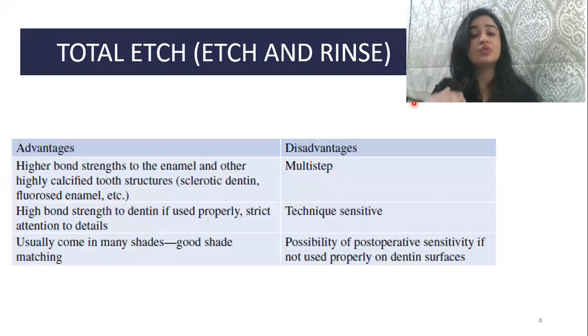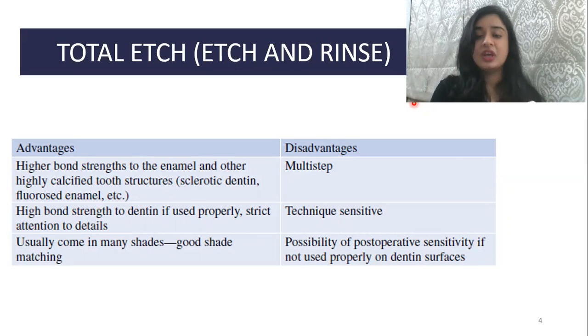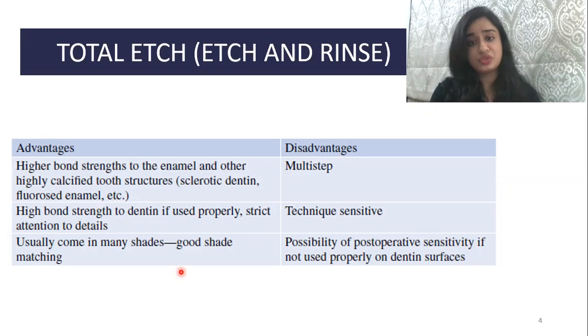So when there is a high amount of enamel available, for example, your veneers. In veneers, you need good shade matching. Yes, you need good options when it comes to shades. Along with that, you have a high amount of enamel available. And veneers, the lithium disilicate or feldspathic porcelain, are low strength ceramics. So if you need bonding in those cases, you need bonding with a cement which has good strength. So this will be the type of cement that will be used. I'll be discussing this later as well.